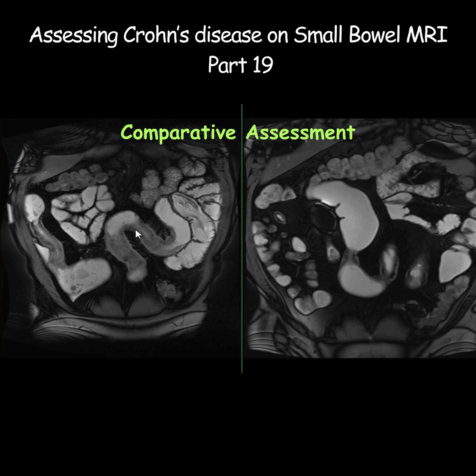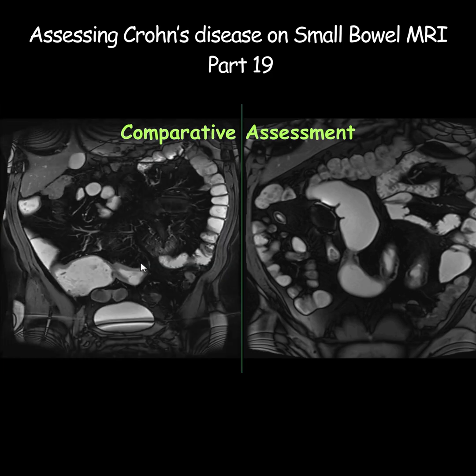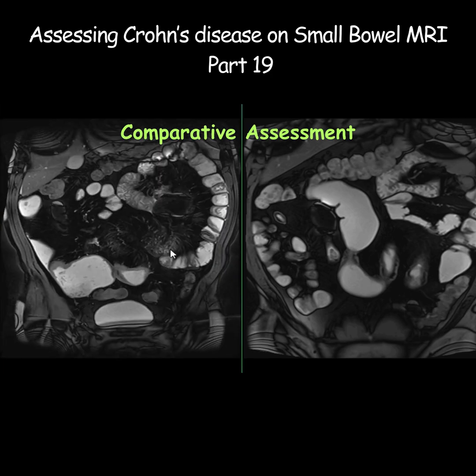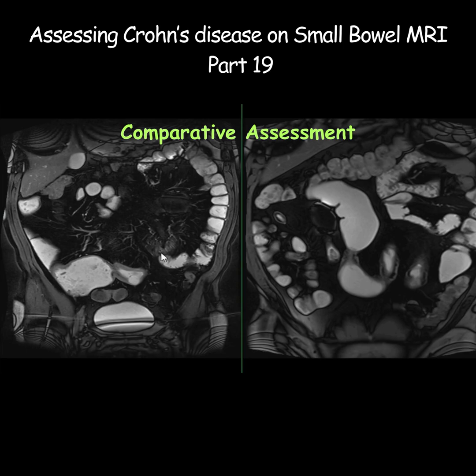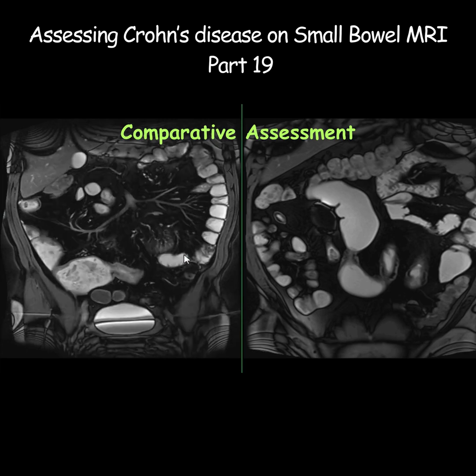Compare it with the more recent scan. The bowel wall thickening has significantly increased, it appears more edematous, there is more surrounding edema and vascular engorgement. Can you see this edema in the fat?